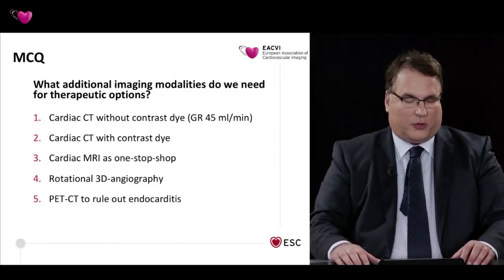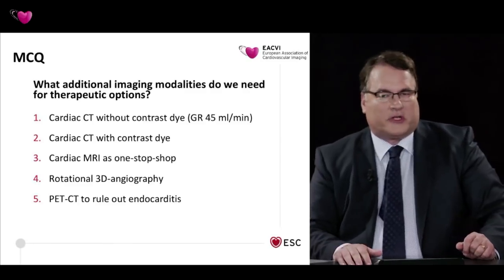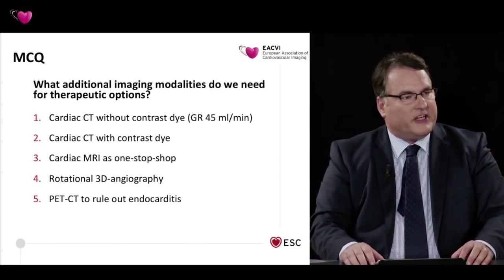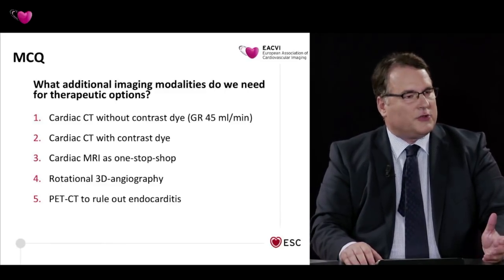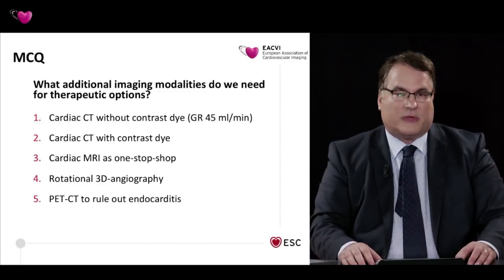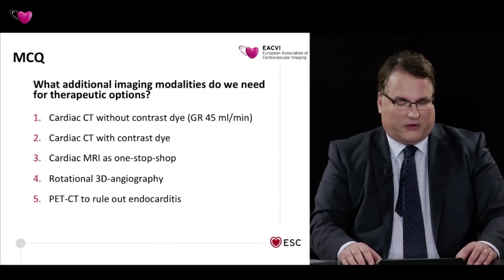Also, this poll is open for voting for another 35 seconds, and I think this is a very important question because it addresses the differences between radiology tools. MRI is a non-radiation tool that gives us additional flow information, but cardiac CT could also give additional information on the calcium distribution, which is excellent actually to see devices. Calcium has a very high resolution, and perhaps we'll address shortly also 4 and 5. There are 2 seconds remaining, and we look for the results.